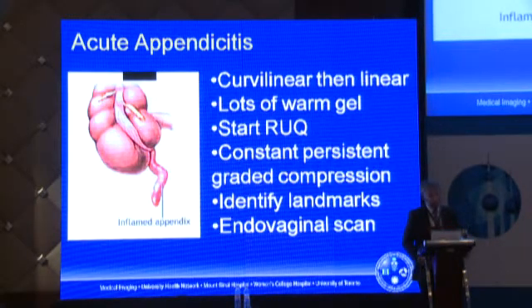What happens sometimes, unfortunately, is you follow down, and you realize that the cecum is deep in the pelvis, often sitting on the bladder dome, and then my chances of finding the appendix, at least suprapubically or transabdominally, are greatly diminished. I do that very quickly. It only takes probably less than 30 seconds, and then I have some idea of what I should do, and then I quickly change over to a linear, higher frequency transducer.